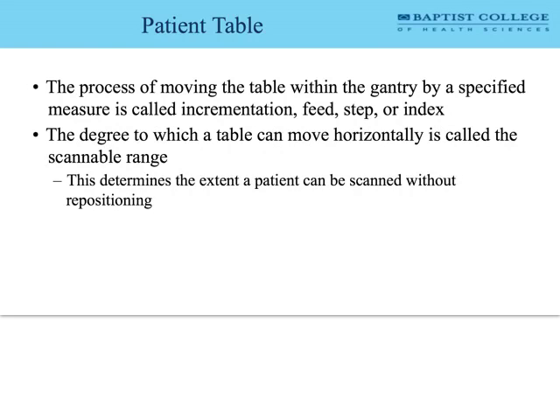Because what's coming off of the detector array is just an electronic signal. It's a bunch of ups and downs of an electronic signal. That is then digitized. And that's what the computer is going to use, is that digital data, ones and zeros, right? Binary code to construct an image.